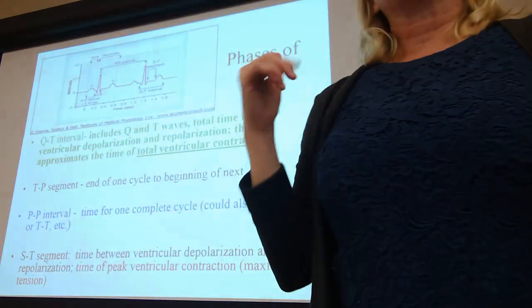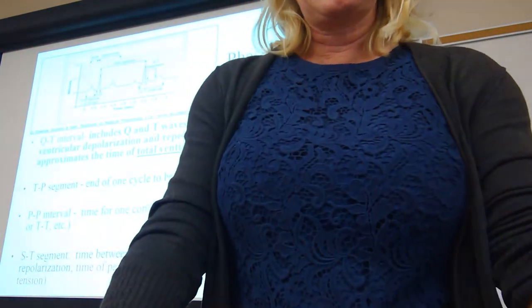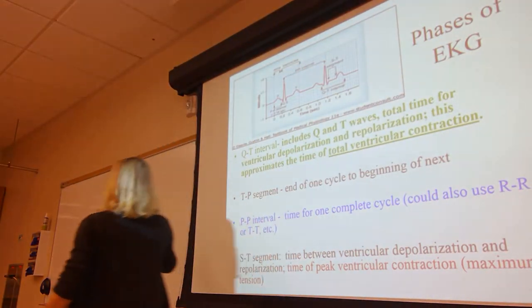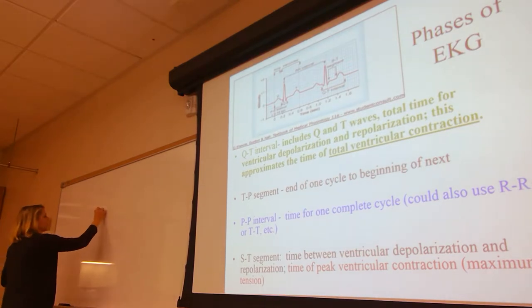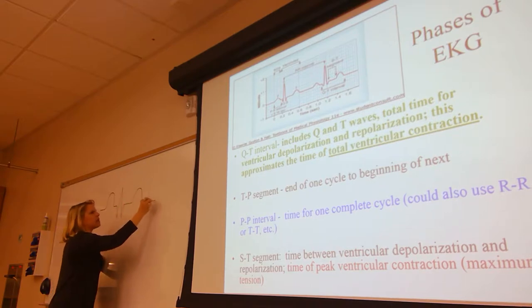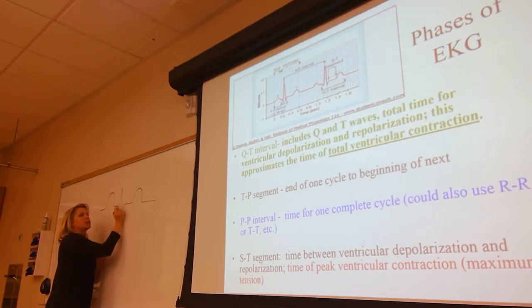Okay, so what else are you going to be responsible for knowing with these segments? Where they begin and where they end. By that I mean, you are going to know on your EKG, let's do the ST segment. Segments are flat lines. So here's the beginning of the ST segment when I return to baseline after the S to the beginning of the T.